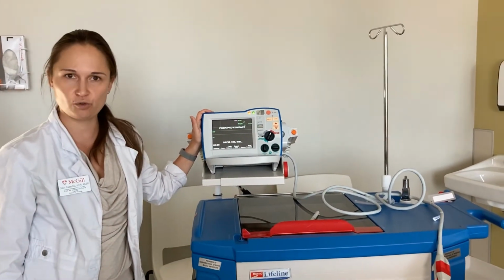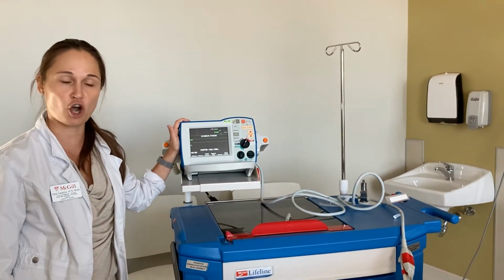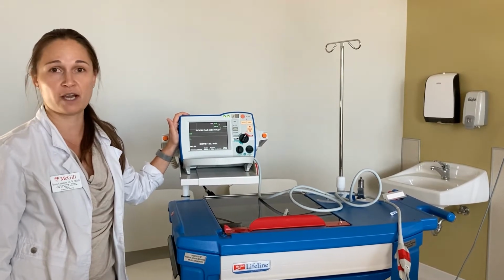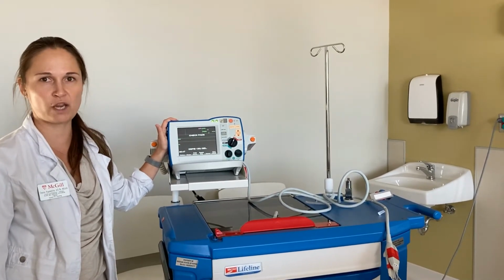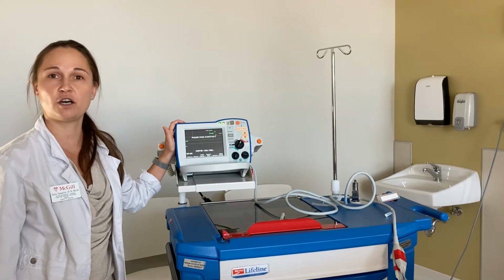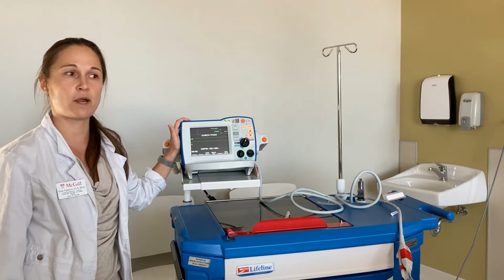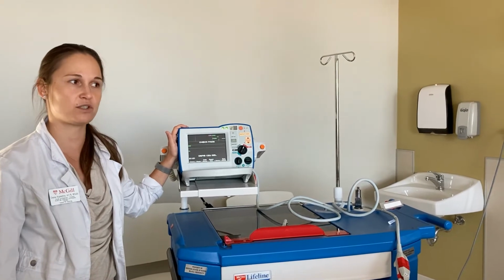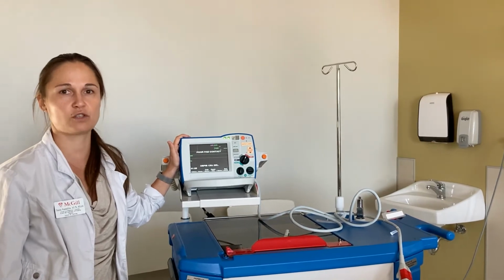What are we synchronizing to? We are synchronizing to the patient's heart rhythm, and there's a particular part in the QRS where you need to deliver a shock. Because if you think about your patient's electrocardiogram, you will remember that right after the QRS complex, you have a period that falls between the R wave and the T wave, where the heart is in an absolute refractory period, and the second part of the T wave is actually quite dangerous because it's a partial refractory period, and the shock delivered there can actually precipitate a very lethal cardiac rhythm, for example, a ventricular fibrillation, which is the most common.